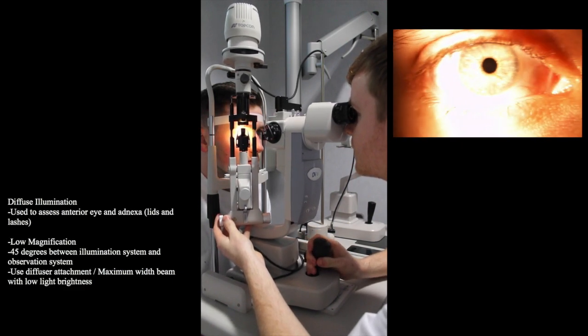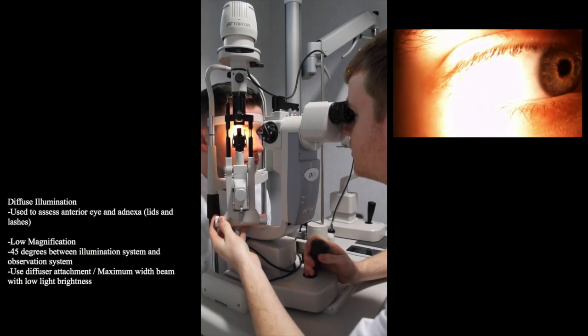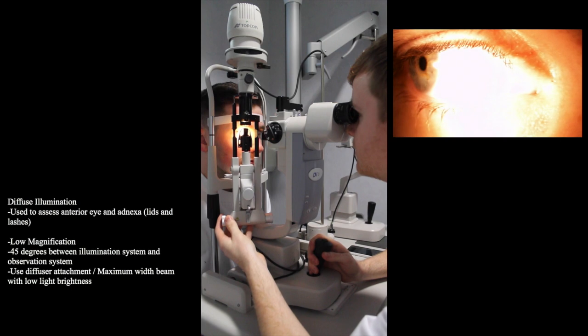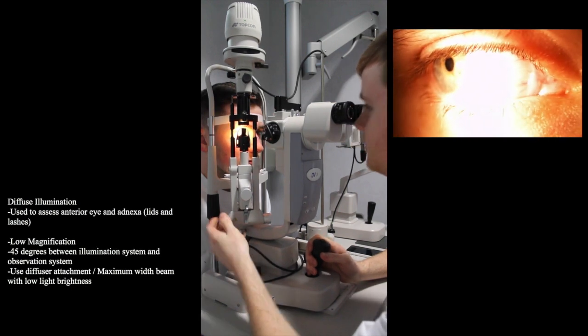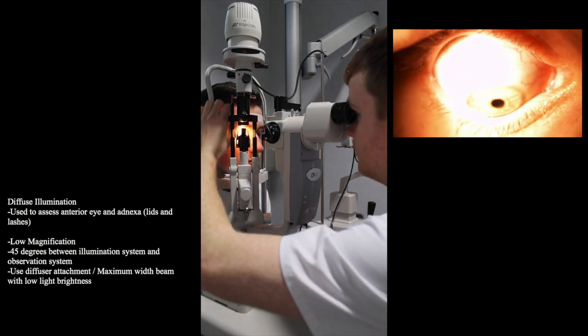Secondly, ask the patient to look in different positions of gaze to have a better look at the peripheral bulbar conjunctiva. When looking in the downwards and upwards gaze, it is beneficial to hold the patient's eyelids. You should warn the patient you are going to do this beforehand.